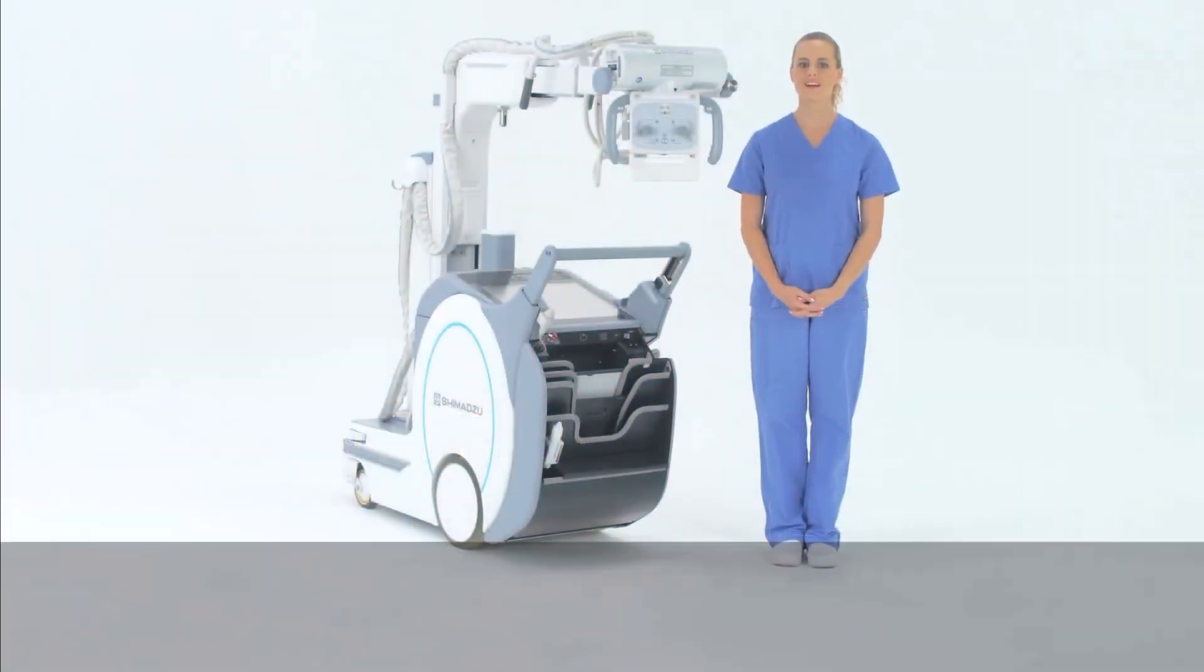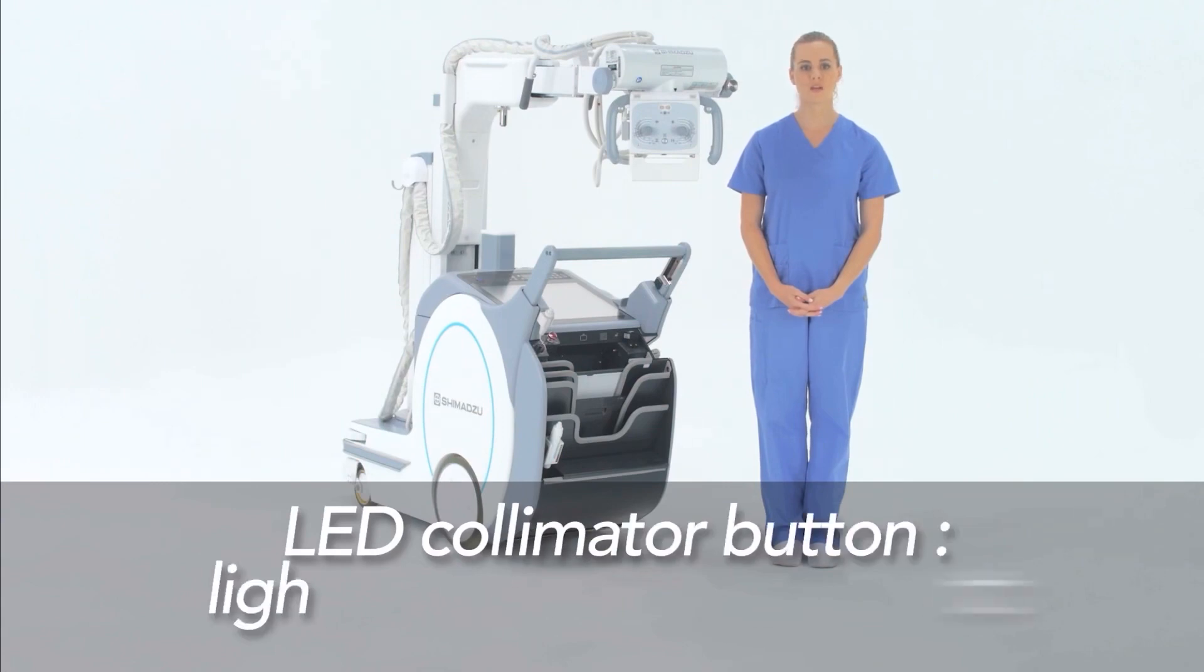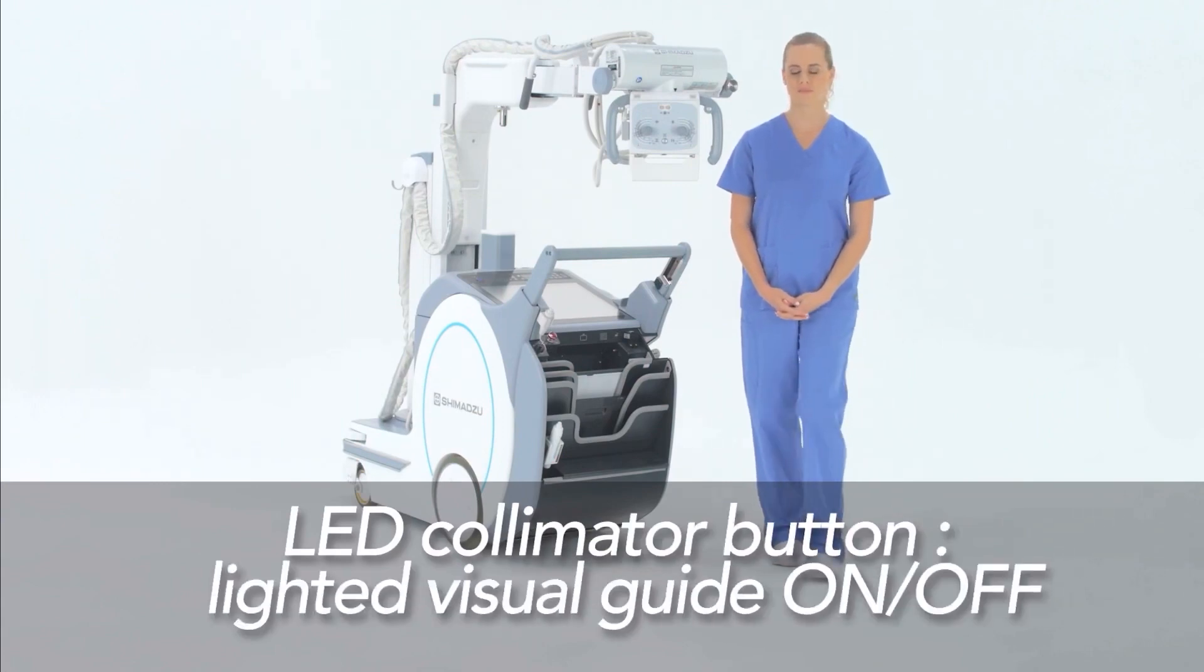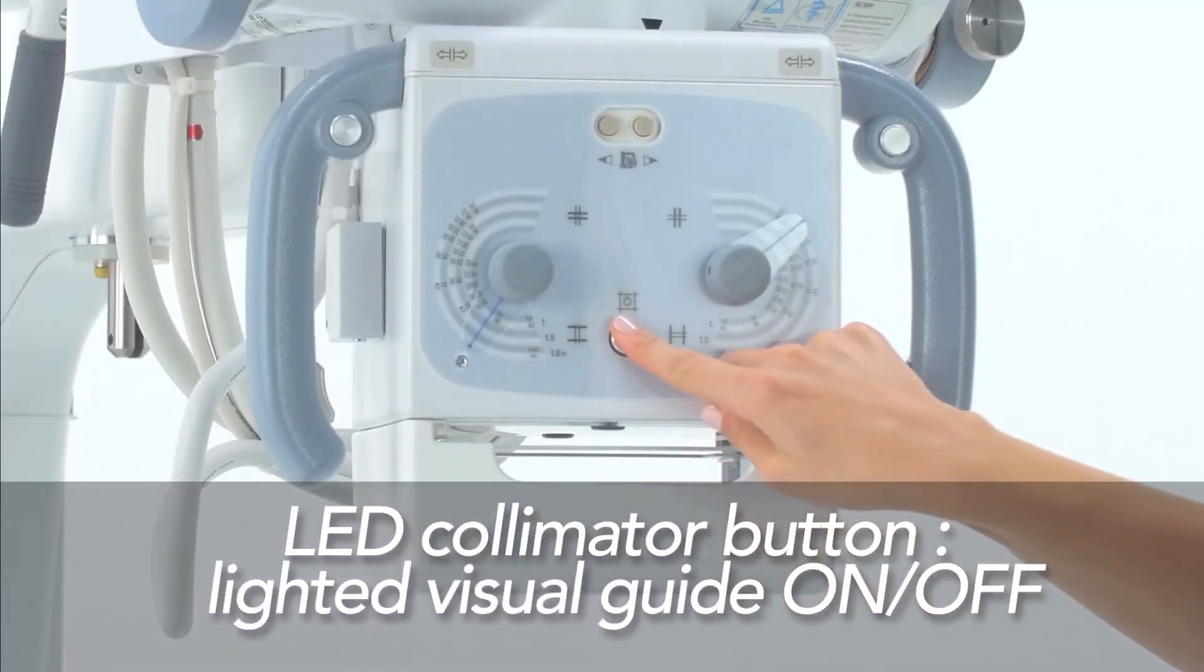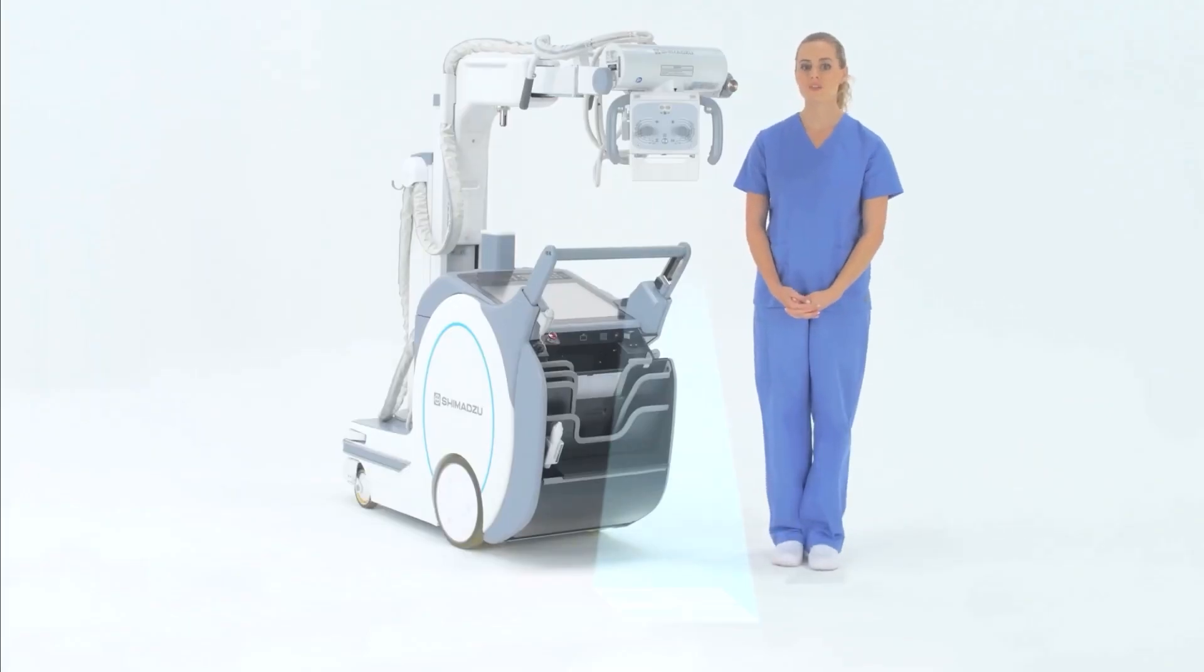The LED collimator button provides a lighted visual guide of the irradiation field. The light can be adjusted using the field adjustment knobs here.